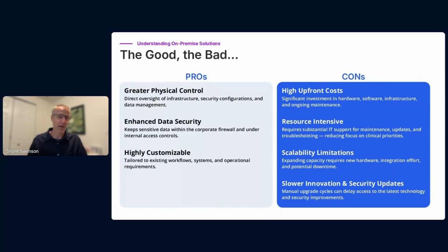This does often mean, for these complex systems like a digital pathology solution, that this is a significant IT project. And so this is going to take IT staff that are responsible for that initial design and build, as well as maintenance updates, troubleshooting, handling downtime, things like that. If you find that your practice is growing or your needs are changing, this is going to require additional capital investment, additional upgrade projects in order to scale with ongoing changes in workloads.